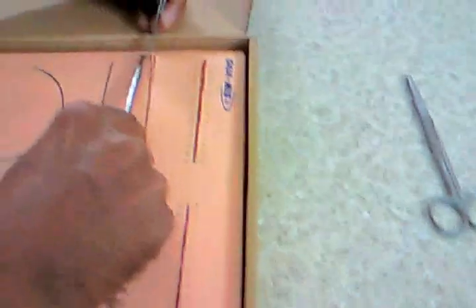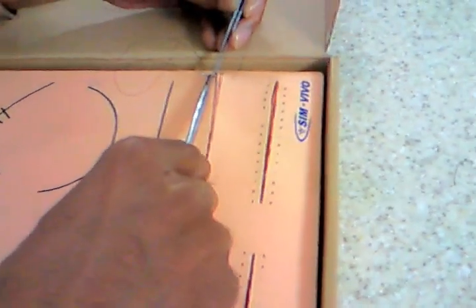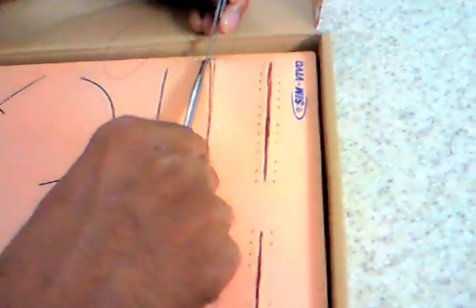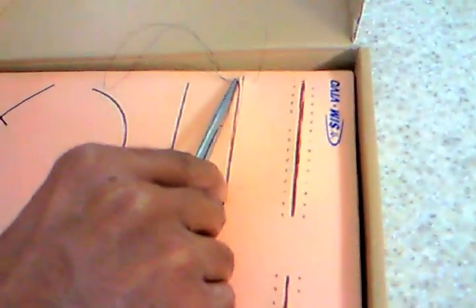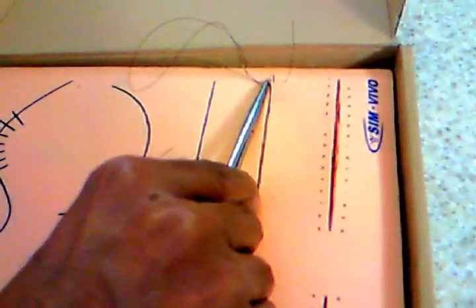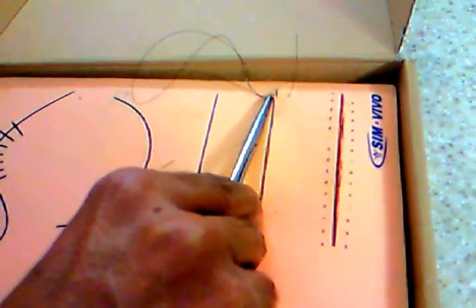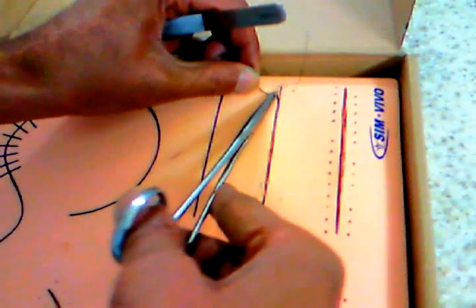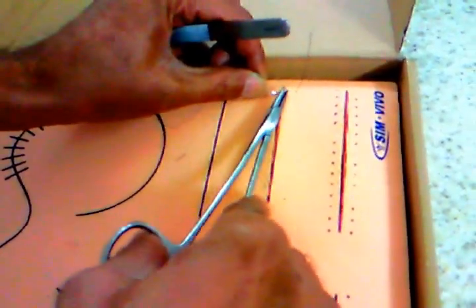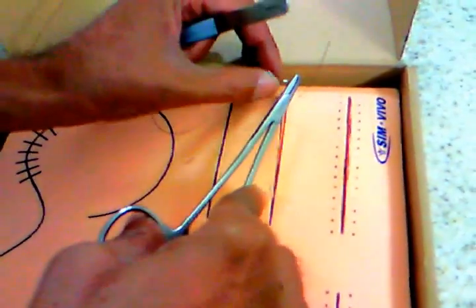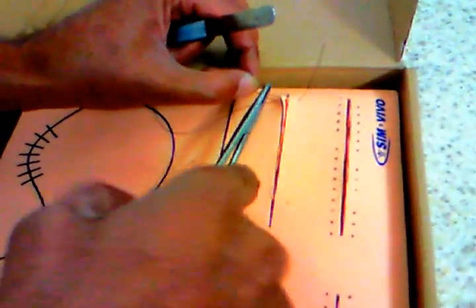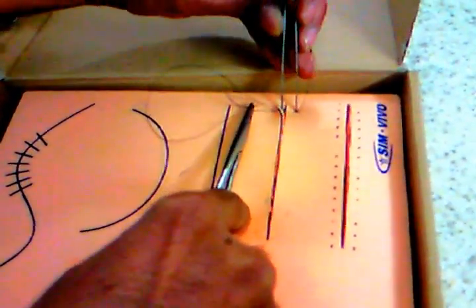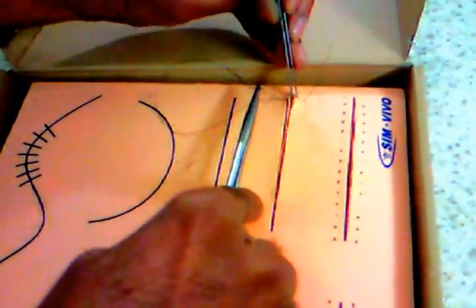Exactly at the dermo-epidermal junction. You can see the tip coming out? At the dermo-epidermal junction. Give it a little push. Again, hold it. Opposite side. Dermo-epidermal junction.